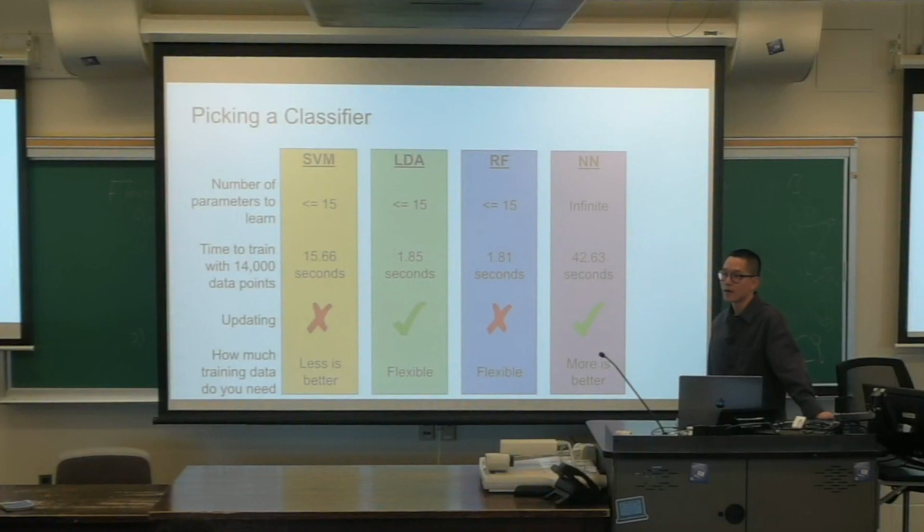That's a valid point. Yeah. So it looks like LDA and random forest are the most tempting solutions. In fact, I think both of you are right. For this work right now, we actually choose random forest. But for the next work, in the second stage of the lecture, we're going to talk about work where we use LDA.